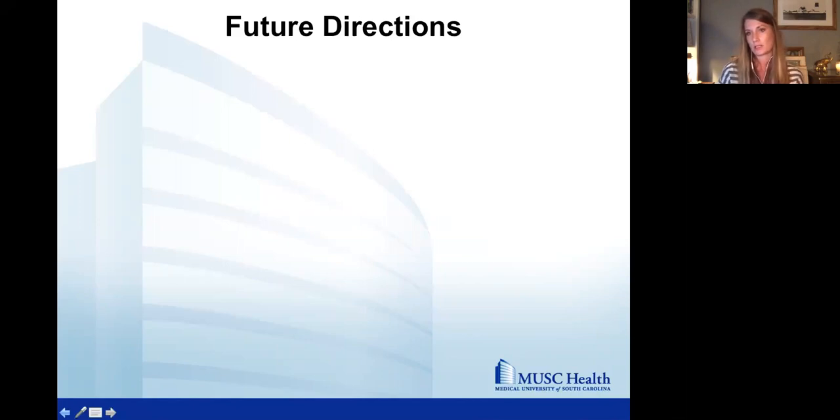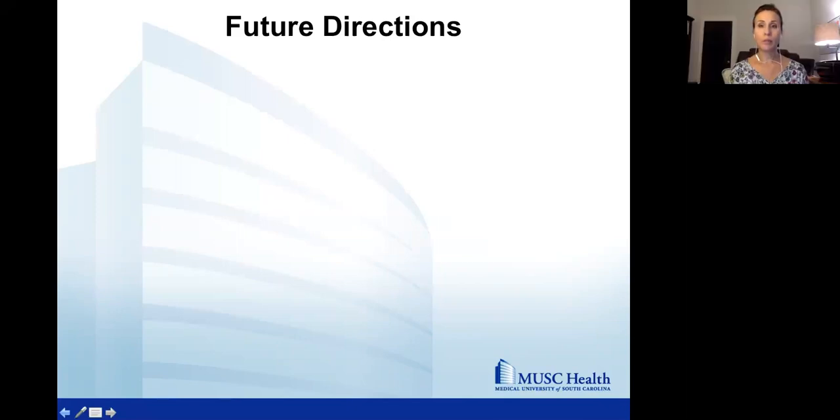For us, we are a separate department, the speech pathologist, and so we do bill just a therapy code. There is a biofeedback code that you can bill on top of that. I don't have those codes in front of me, but we'll provide our emails and we can send you that information. Ashley, do you want to speak to how you bill for your evaluation? When we do a pharyngoesophageal manometry, we bill that as an impedance pH study.